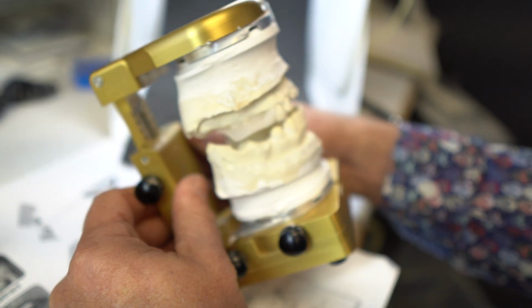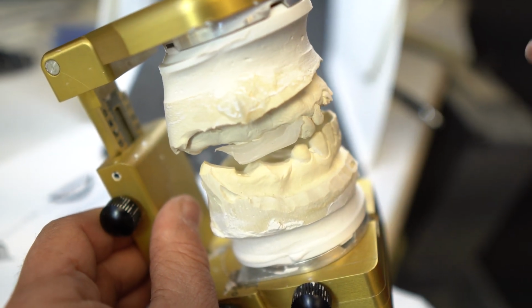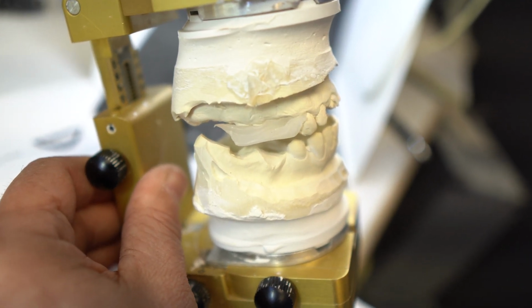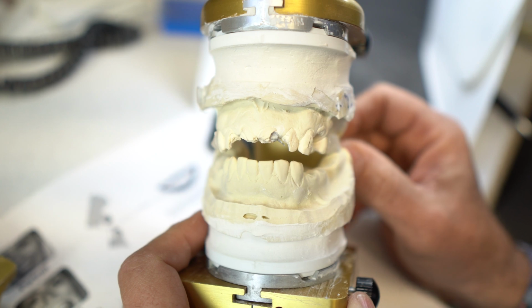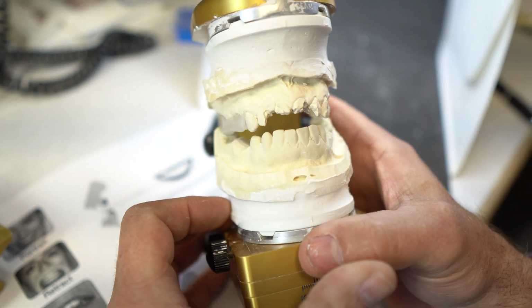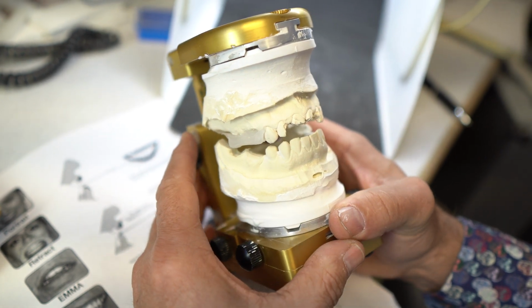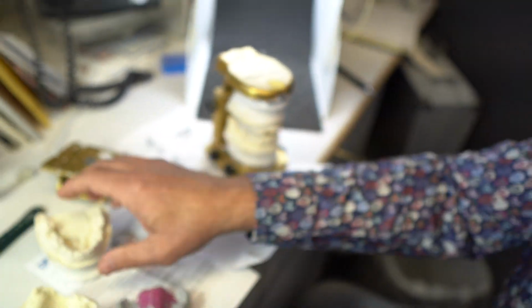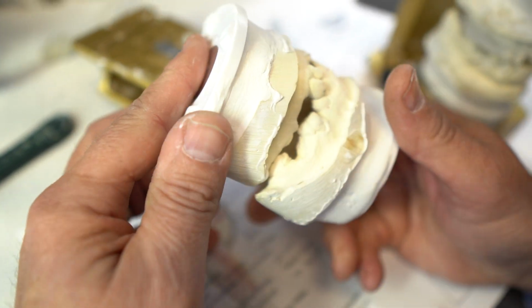So now, if you have a look here, I haven't even actually closed down to the patient's centric, or let's just call it his bite, okay? It's not centric occlusion. It's not really CO because he doesn't really have a bite. But if I want to level these things off, you can already see I'm hitting on the retromolar pad area and or this tooth. So where I'm going with this patient, and just looking at teeth that are this, this is what the patient's bite actually is.